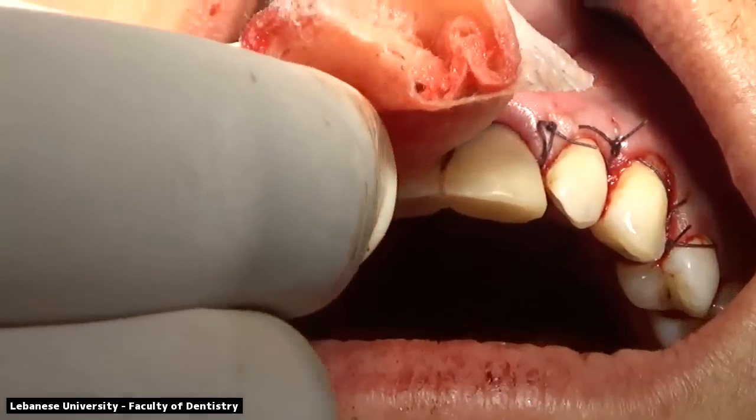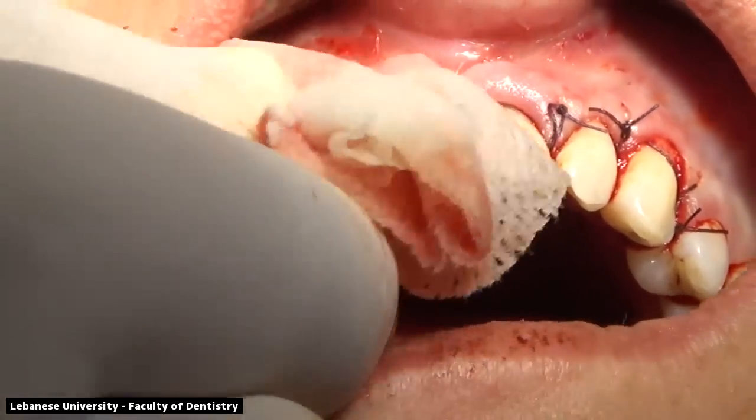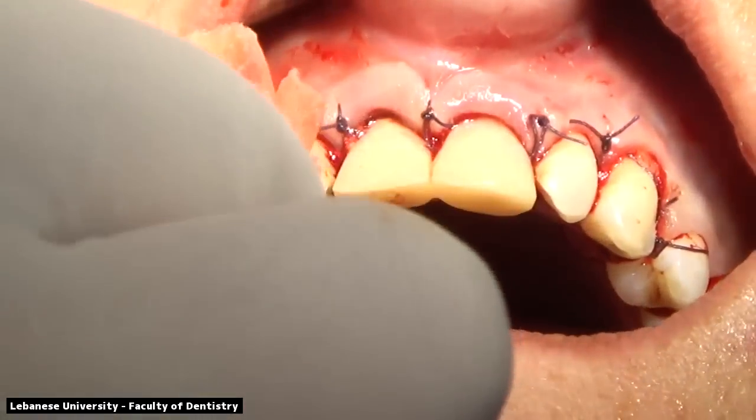There is an edge-to-edge component of the overjet because the patient has a crossbite, so we try to adjust it in that manner.